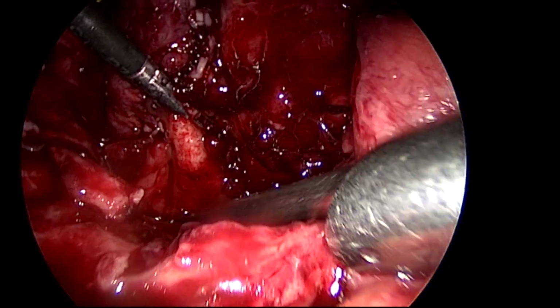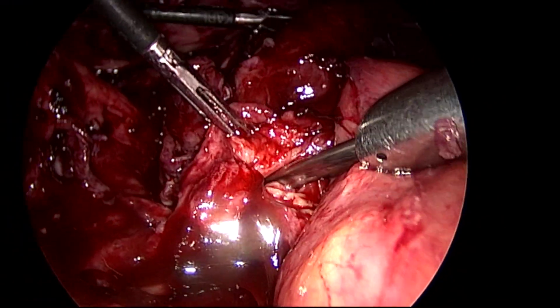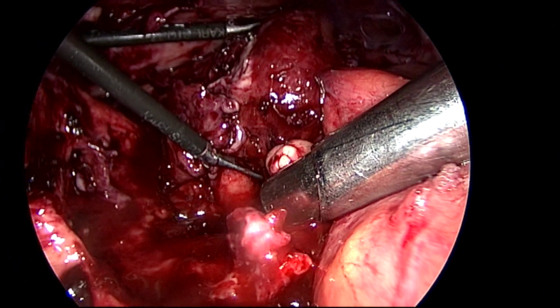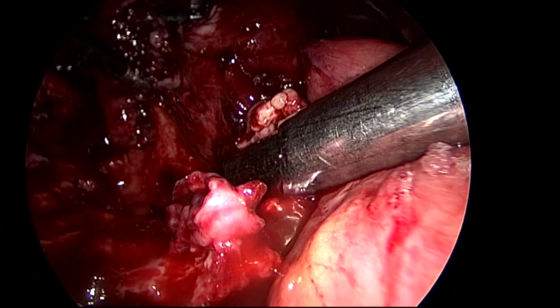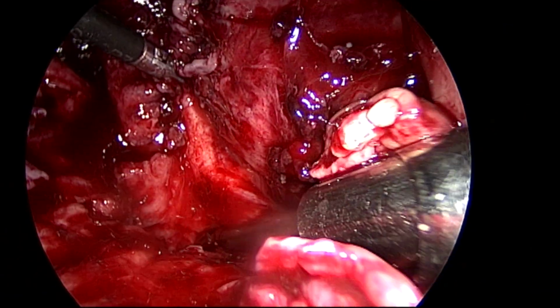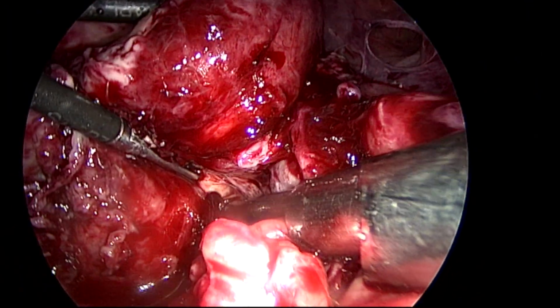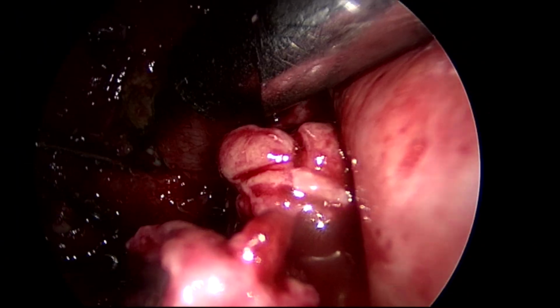So, here I released the entire omentum from the upper abdomen and then the omentum from the falciform ligament. Left lobe liver adhesions and collection I released, and I cleared that area. Then I came to the falciform omental adhesions. Then I went laterally and released all the omentum. Then I could see the liver, right lobe of liver. Then omental adhesions on the gallbladder are released.